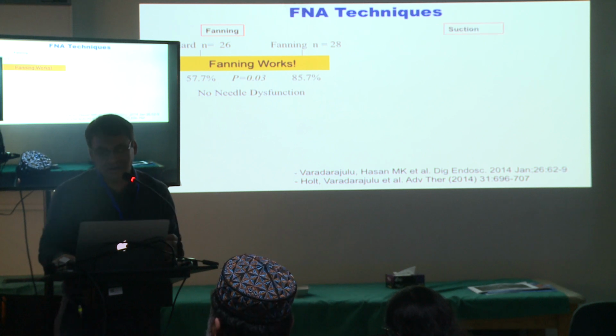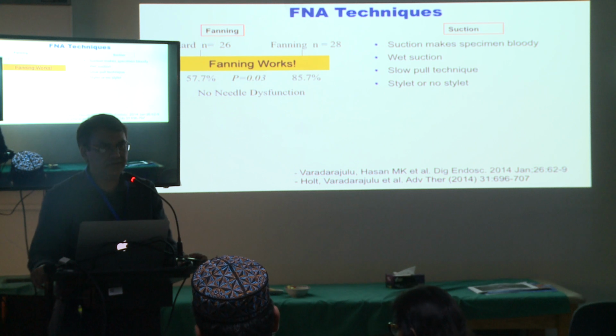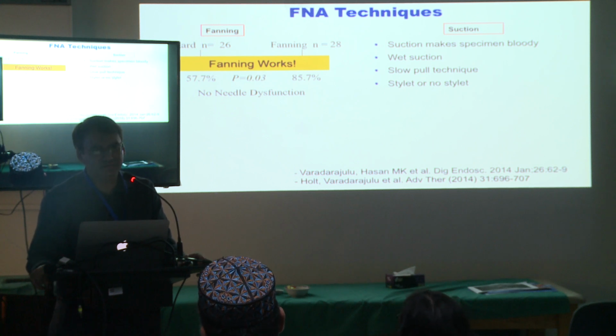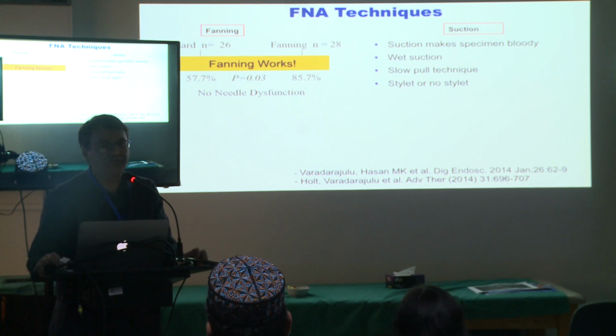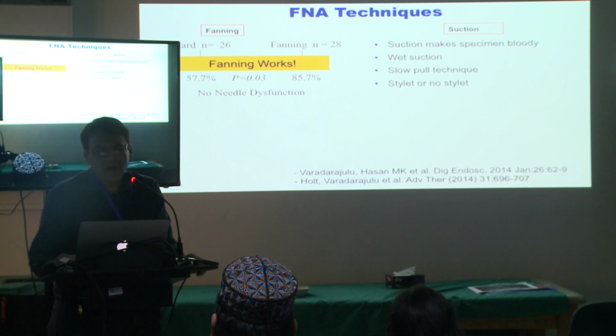Okay, so suction. Earlier people were asking, I think I kind of answered that question. In my practice, it's okay. It's fine, so you'll still get the tissue. Sometimes you can straighten it a little bit, but it's hard.